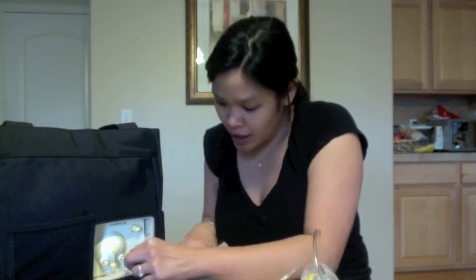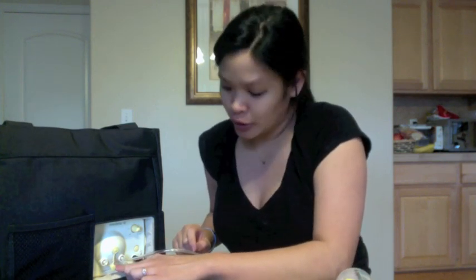As far as if you're going to pump both breasts, then obviously both these little holes are going to get covered by the tube and get connected to 2 of these. If you're only going to pump on one side for some reason, then what you want to do is pull off this yellow membrane right here. This is just a holding thing for it. It's not open to anything, but you want to plug the other side that you're not going to be using.